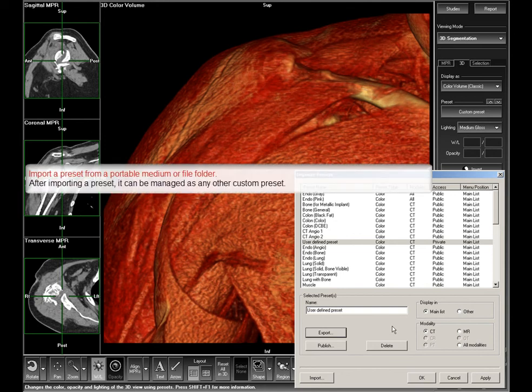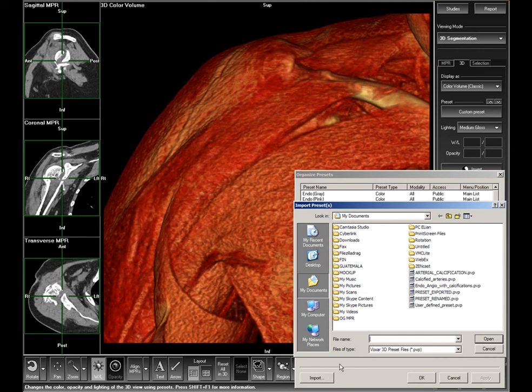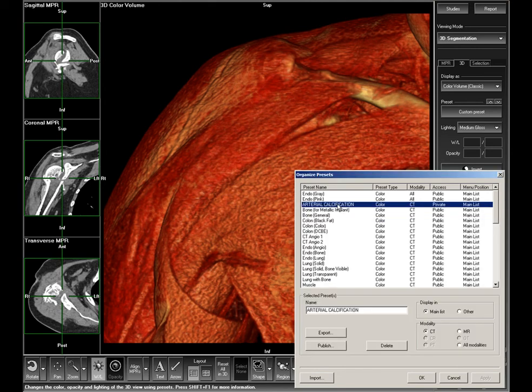To import a preset from a portable medium or file folder, click Import. After importing a preset, its name can be changed, it can be published to make it generally accessible, or its location on the presets drop-down list can be chosen.